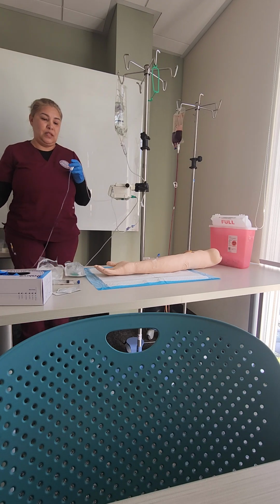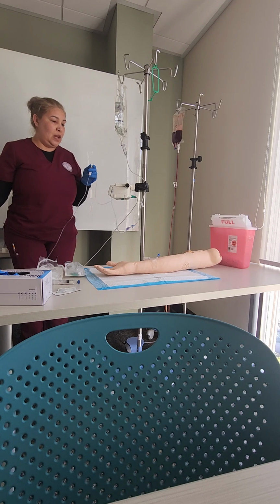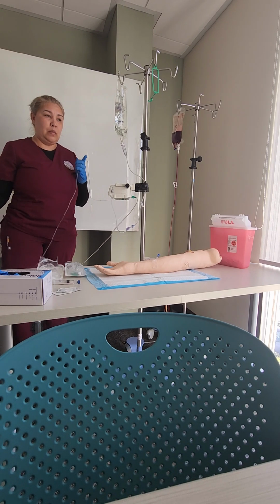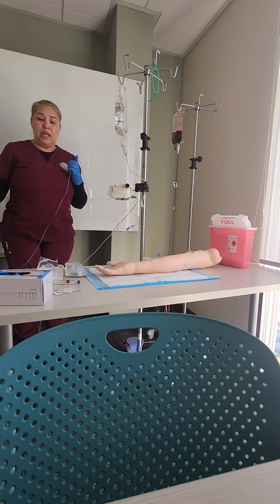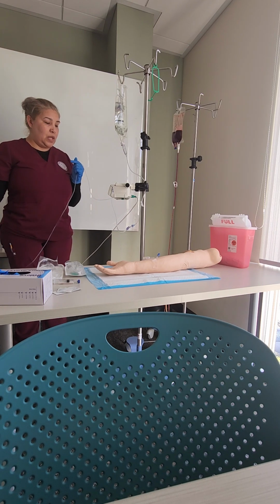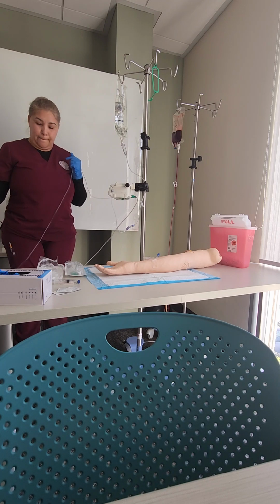And while this is priming, this is a perfect opportunity to ask my patient if they are allergic to any medications. My patient said no. I had already previously confirmed, but I also want to ask my patient, just to be on the safe side, if they are allergic to any latex. They said no, so that is perfect. Just conversate with my patient while this is priming.